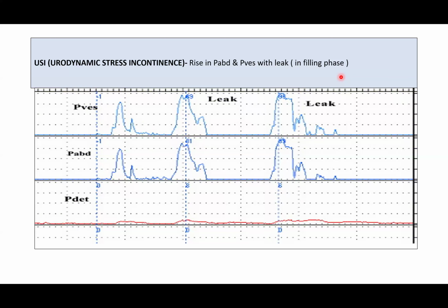With sensory bladder, the urodynamic studies will be normal because that is not a motor problem. That is a sensory problem. So the history will be nearly the same as your overactive bladder history, rushing to the toilet. But to differentiate between your detrusor overactivity and sensory urgency, urodynamics is done and the studies will be normal. Then what will be the treatment for that condition? It is the same as for urge incontinence, like overactive bladder: conservative management, lifestyle modifications, anticholinergics. Usually surgery is not required in that.